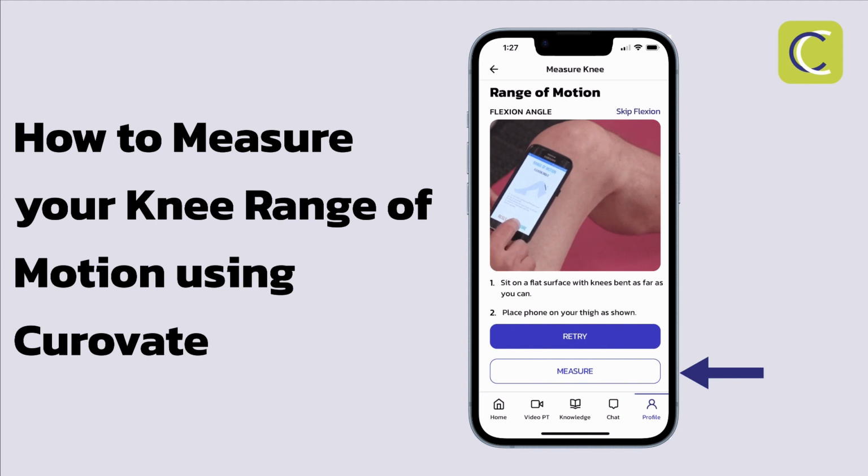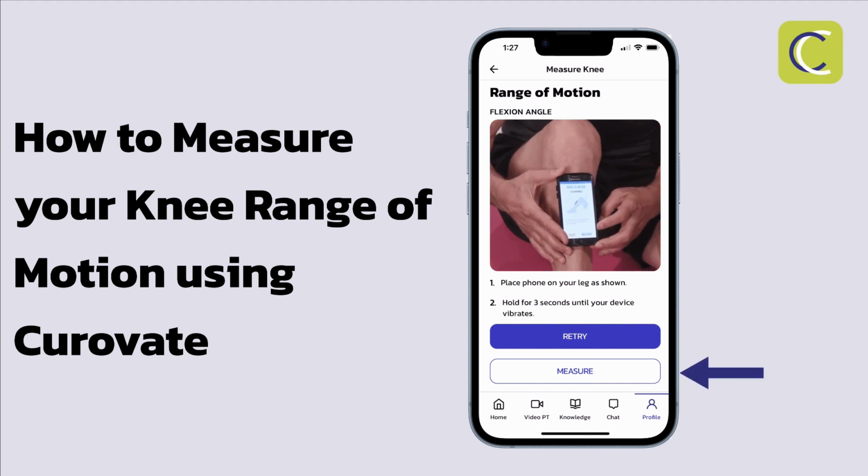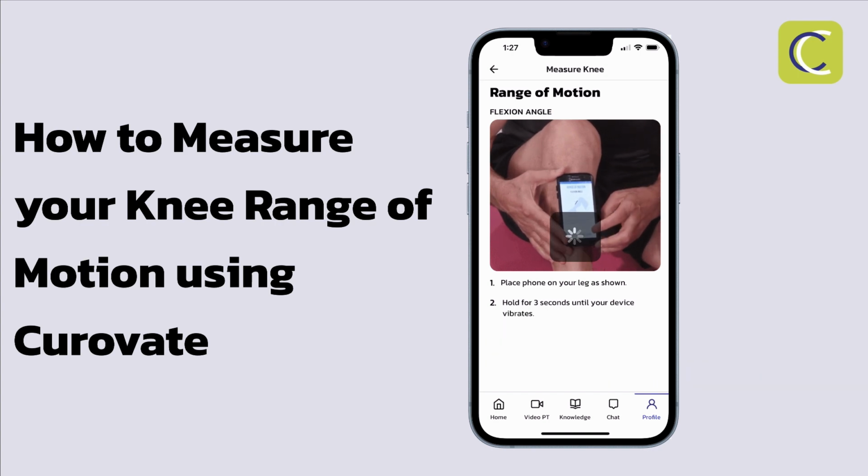Next, bend your knee as far as you can, place the phone just above your knee and press Measure. Then, move the phone to below your knee and select Measure again. You've now completed measuring knee bending.